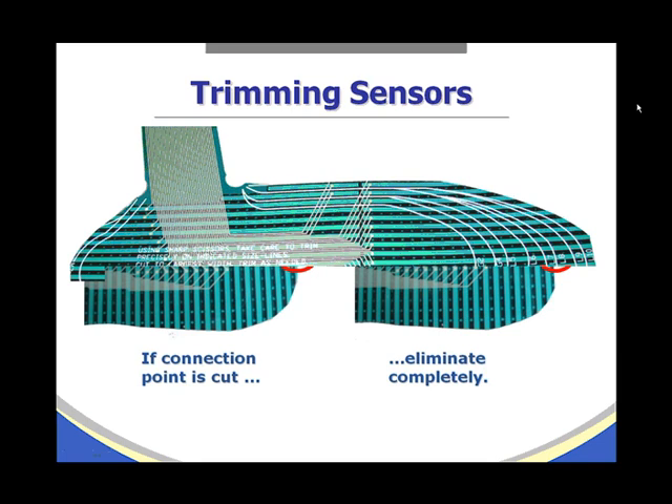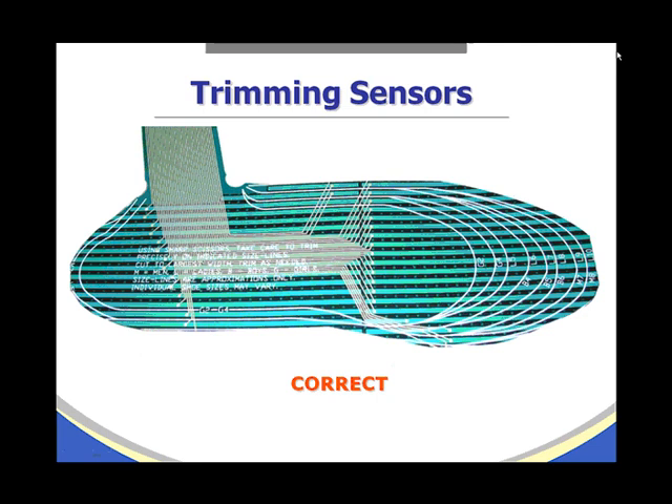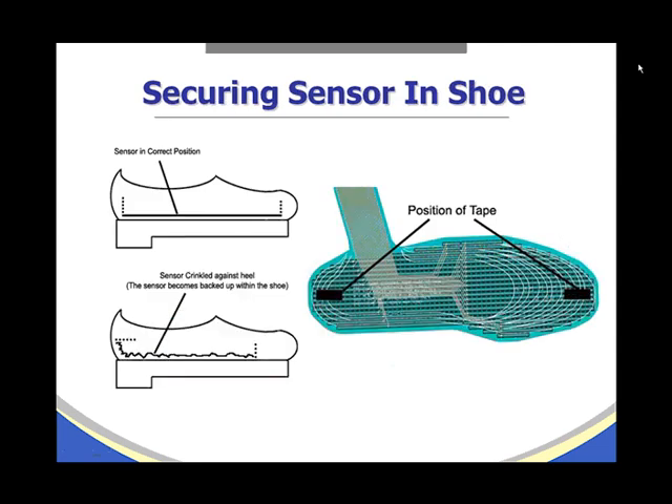Here is an example of a correctly trimmed sensor. When securing the sensor in the shoe, it is extremely helpful to use two-sided tape — place a piece approximately two inches at the heel region and at the toe region on the side of the sensor facing down toward the insole, then press it into position. This holds the sensor in place and minimizes crinkling and sensor shifting as the patient walks or moves.